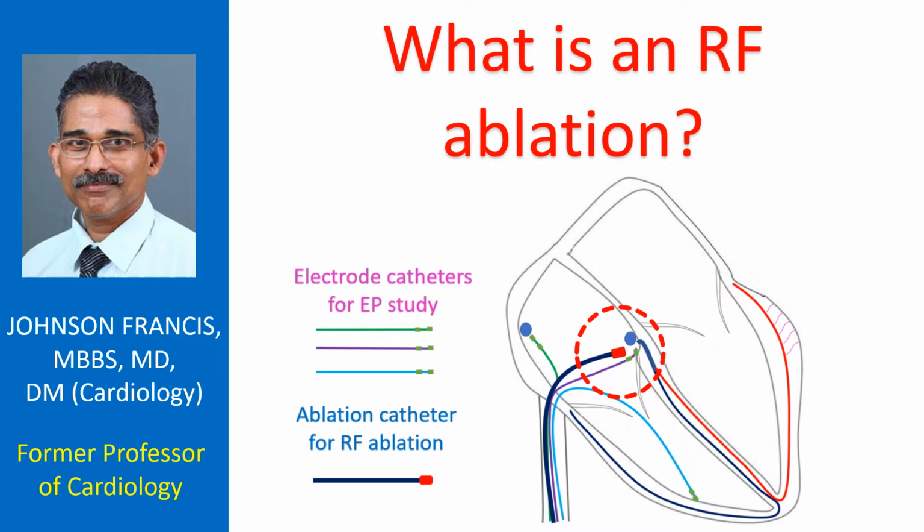While the energy is radiated as radio waves in radio transmission, in RF ablation, it is delivered to small regions of the heart using specialized wires known as ablation catheters. This produces a tiny superficial burn in the region which abolishes the abnormal electrical activity in the heart.